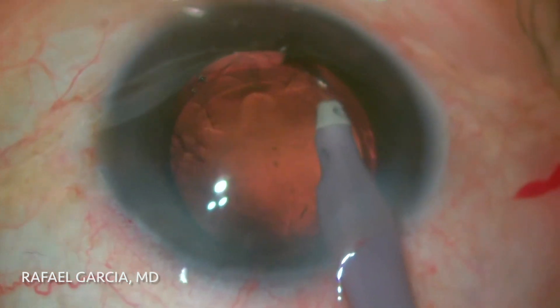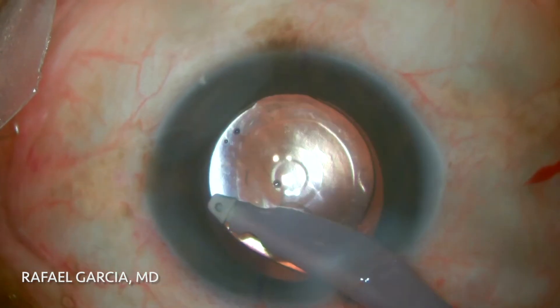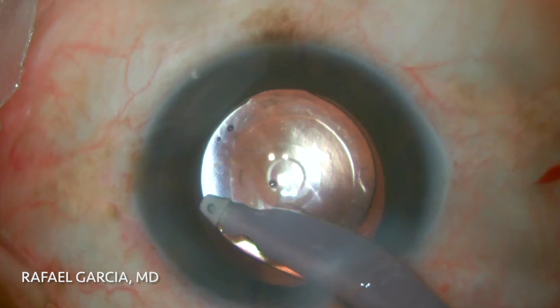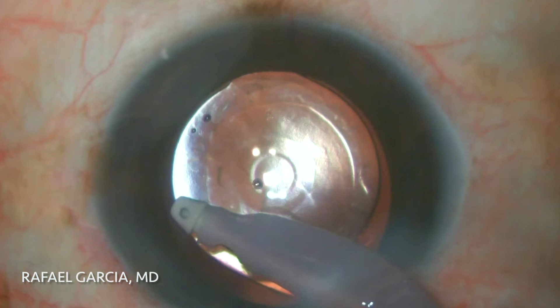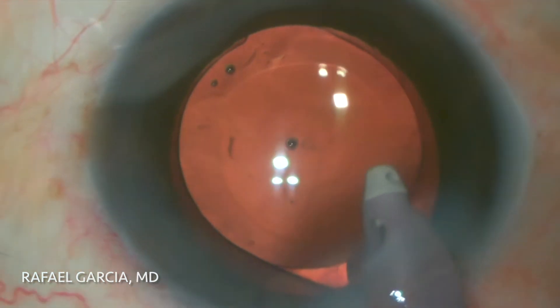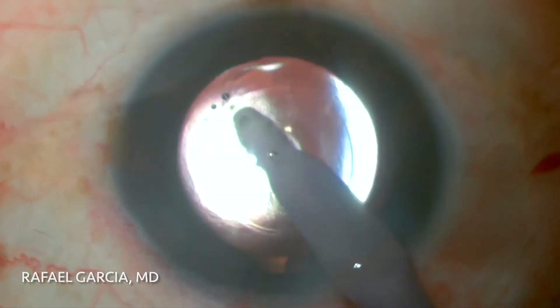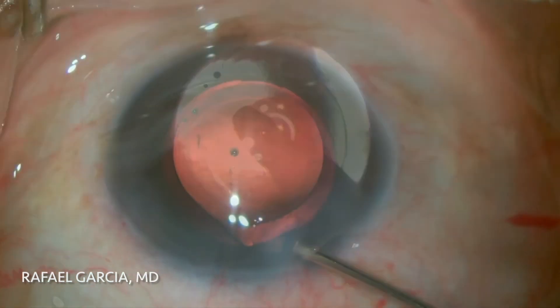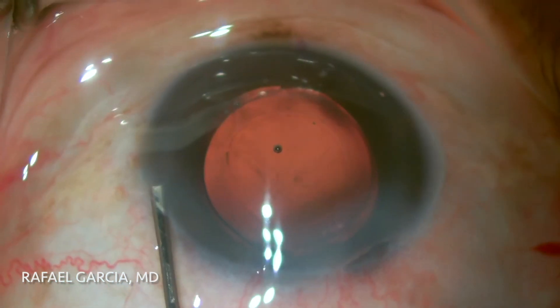As opposed to the PanOptix lens, the Vivid IOL does not have diffractive rings, so it does not cause nighttime halos. Instead, it has a central shaping beam element that modifies the wavefront of the light, providing some gain to the intermediate visual acuity. The better intermediate vision, however, comes at the expense of some contrast loss. Nevertheless, it's quite an interesting type of lens to have in our portfolio, and it can certainly be advantageous when indicated for the right patient.